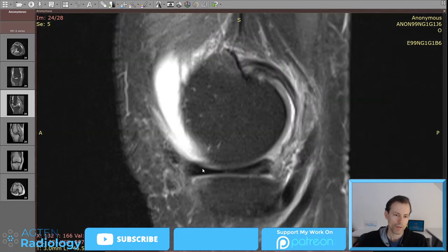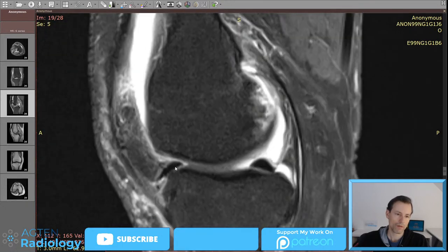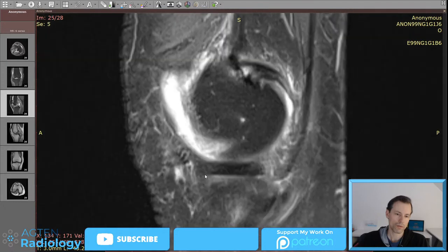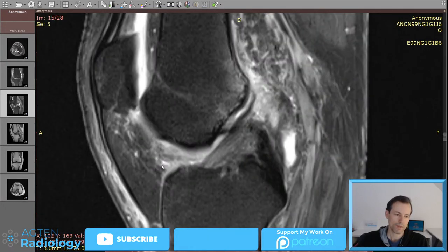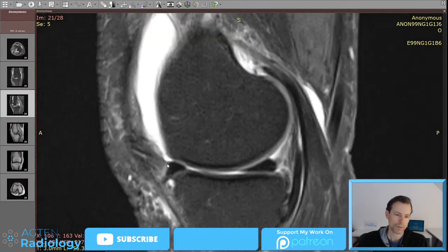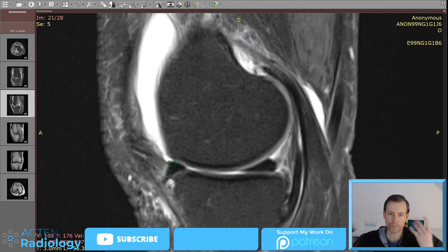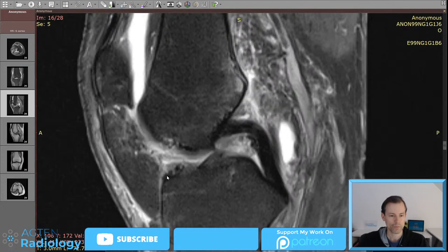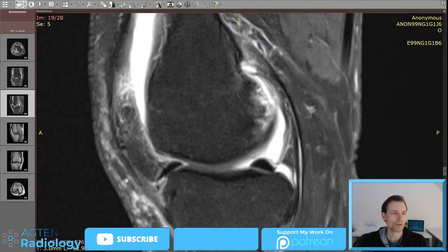This is now on the medial side. Just keep an eye on the anterior root here, how it goes here to the middle portion. And this very tiny transverse ligament, how it inserts into this upper edge here. So we'll have to keep this engram in mind, because we will focus on this on the next case. So I'm scrolling just through, just try to remember how this looks. Okay, I think that's it.